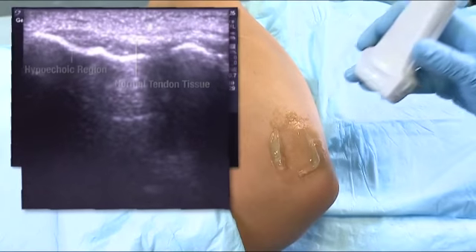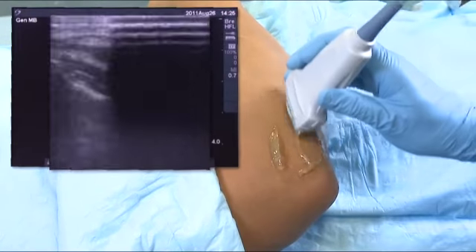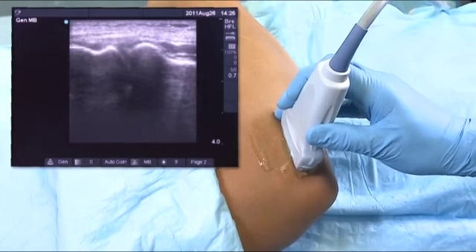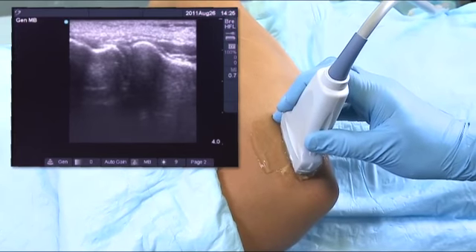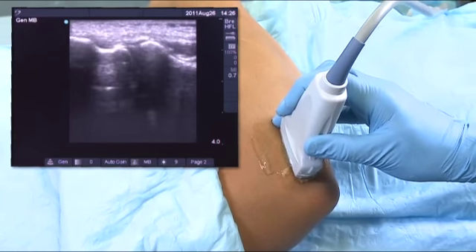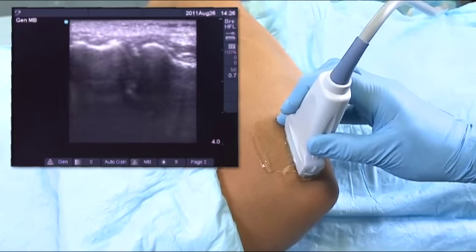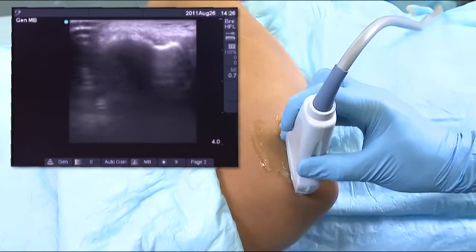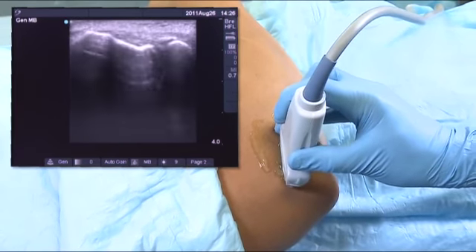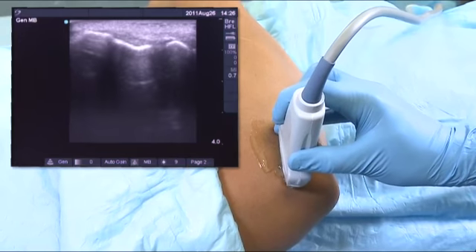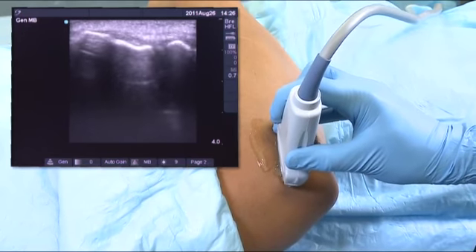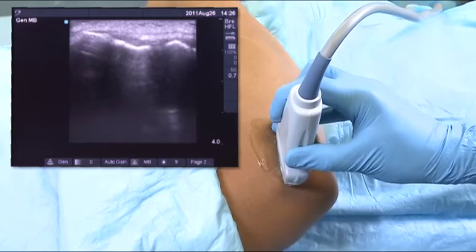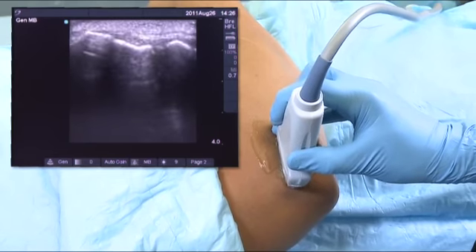If you can unfreeze that we can go back with the exam. Again, we're doing a longitudinal exam with the framework of identifying the radial head, the joint space, and the capitellum of the epicondyle. As I move up proximally I can see the contour of the epicondyle again, and there is the disease showing up as a hypoechoic area.